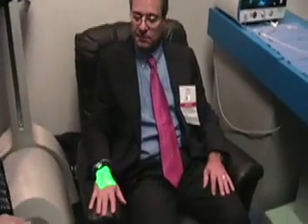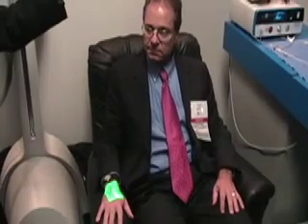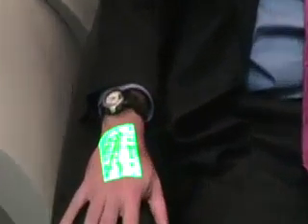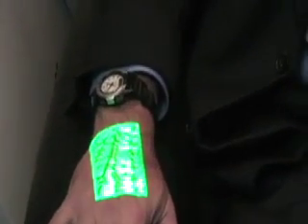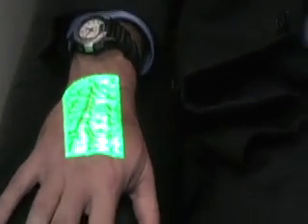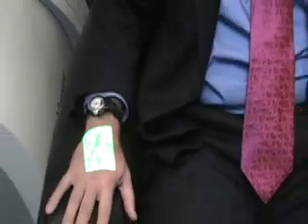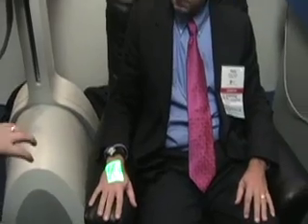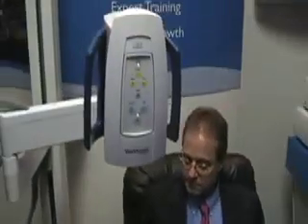This is our vein viewer product, which uses infrared imaging to image superficial veins. It uses infrared detection via CCD. There's a processing algorithm, and then it projects back onto the skin the actual images of the veins down to an 8mm depth. It's a wonderful tool for identifying both the visible veins and many of the feeder veins that feed into them and cause things like spider veins and telangiectasia.